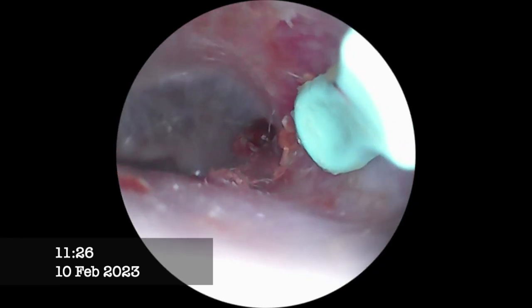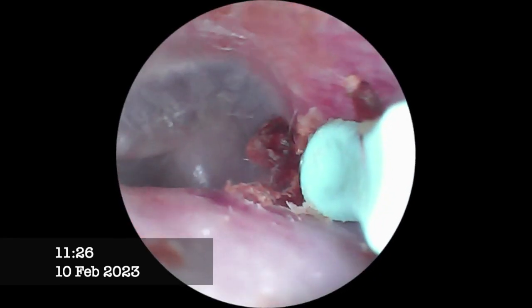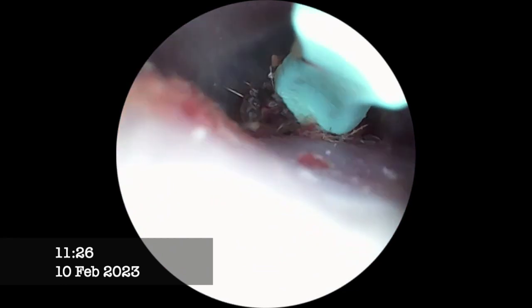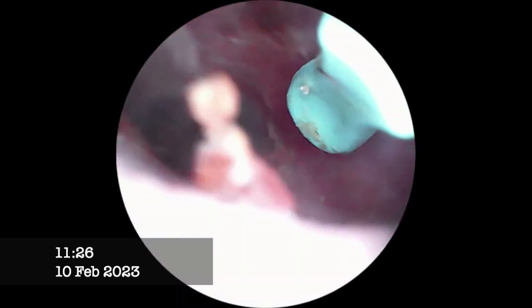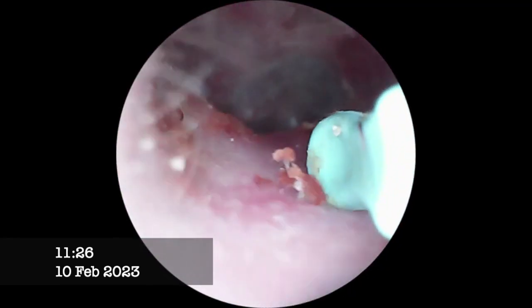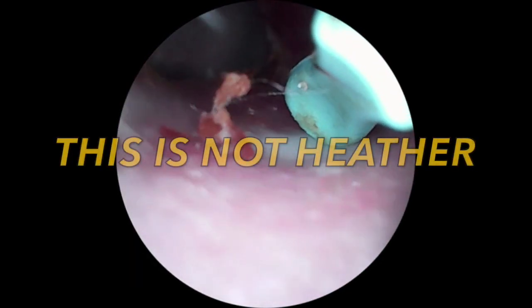How did Heather do? Well, basically she made multiple attempts trying to get the earwax outside of her ear canals using the video endoscope loop, but she wasn't able to get out any substantial amount. She maybe pulled out a few little tiny specks of it that we had to wipe off of the loop when she was done, but at the end of the day, it had no impact on actually pulling the earwax outside of her ear. But since Heather was unable to remove the earwax on her own, I figured that I would go ahead and give it a shot with her permission.